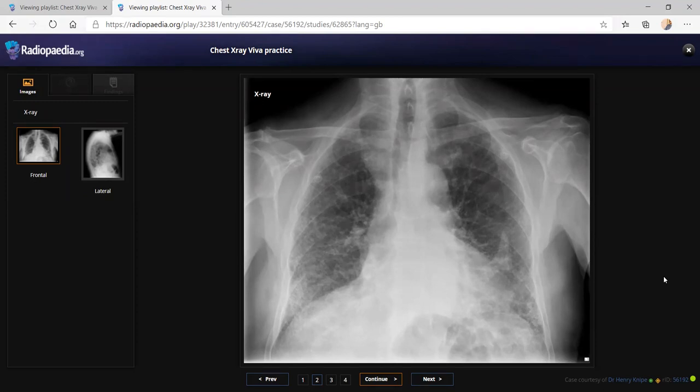No drug-induced changes. Okay. No history of drug and no scleroderma. So in that case, I am thinking of the possibility of an interstitial lung disease primarily. In my usual practice, I like to compare with the previous radiographs if available to check for the progression.